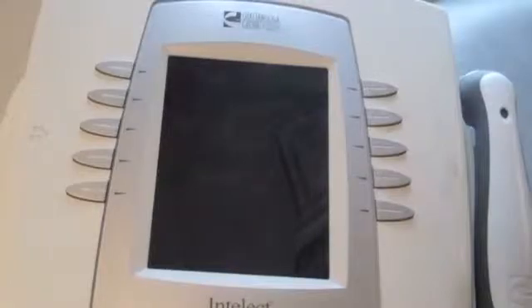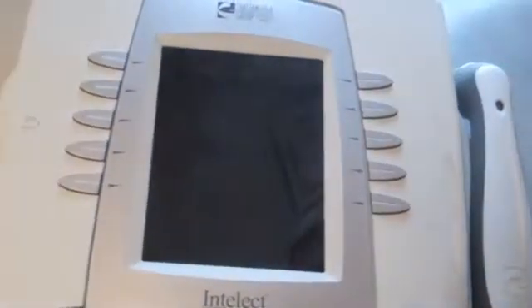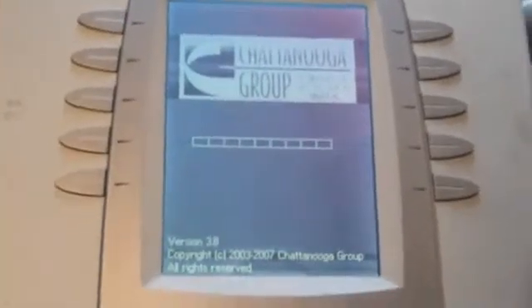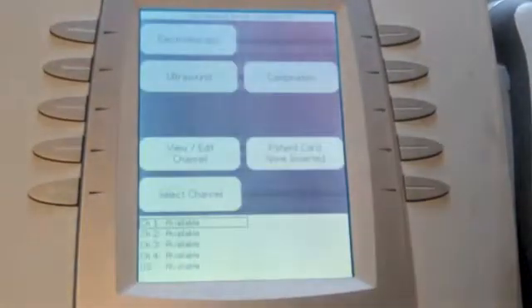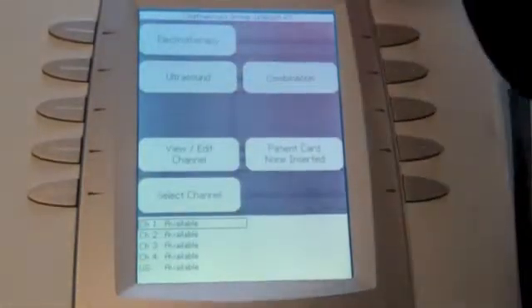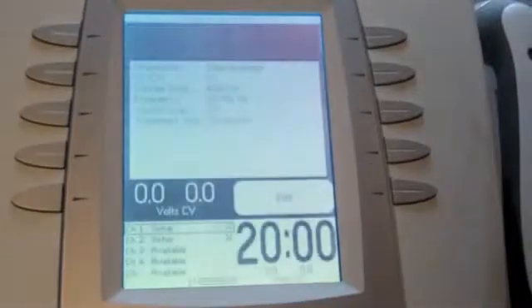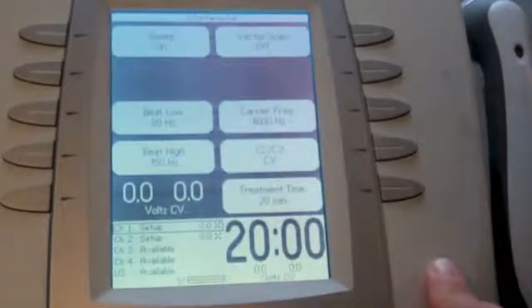So we'll get those hooked back up and then show you how that's done on the Intelect. Okay, turn on the machine, and I'm just going to show you kind of how to set this up as far as what buttons to push. Again, this is IFC for sensory level pain control that we're going to do first. So I know this doesn't come in great, but this button up here, it says electrotherapy, so we're going to push that. And then we're using interferential, so same button. And then down here we can press edit to edit our parameters.